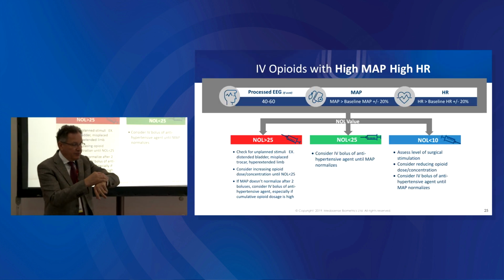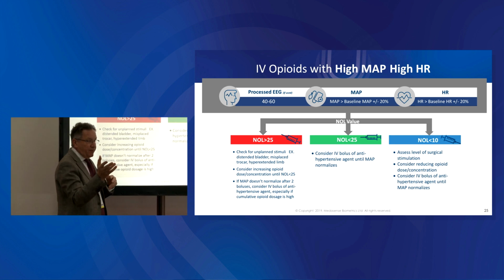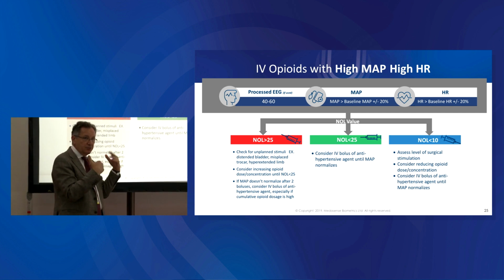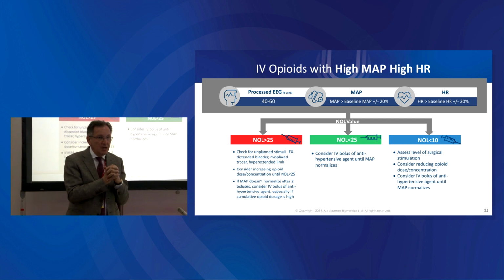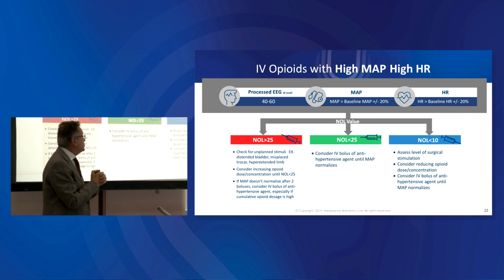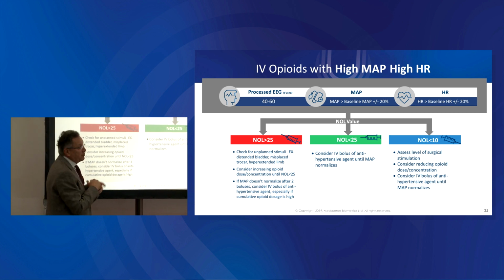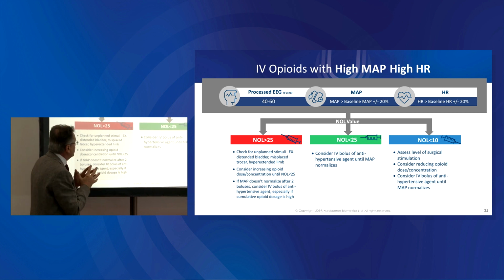And this is where we get to the titration algorithm, okay? If you ask questions, both Professor Sessler and myself, based on the two presentations, I know what Professor Schrag will then show you, but we can bring you arguments, based on the literature, that the things which brought us to build this algorithm actually exist. So the clinical reasoning for a given patient is going to be on 3 parameters. MAP, mandatory, no problem. Heart rate between brackets.